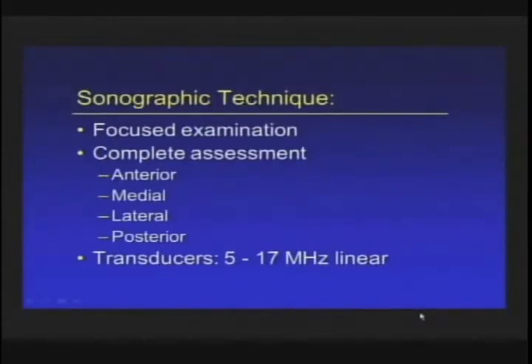And so I approach an ultrasound like I do an MRI. If it says rule out Achilles tendon tear, I'm going to look at everything on every image. I'm not just looking at the Achilles. The same thing holds true with ultrasound.